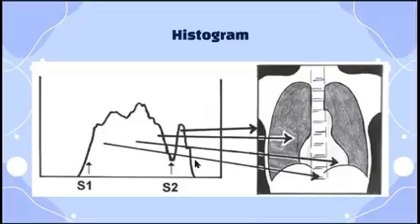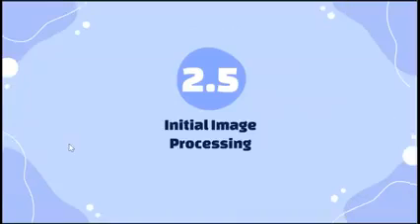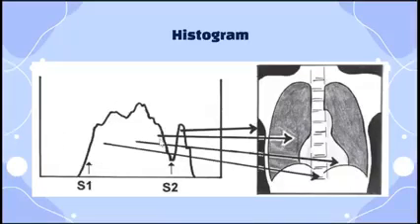Okay? So if ma-analyze ng computer kasali itong tail, no, the brightness and contrast of the image will decrease because di dapat siya kasali. Okay, ang kasali lang dapat is this one and this one, because this area here is of information, yung mga important information lang. Okay? Only data from within the anatomy must be included during the processing, which is from S1 to S2.